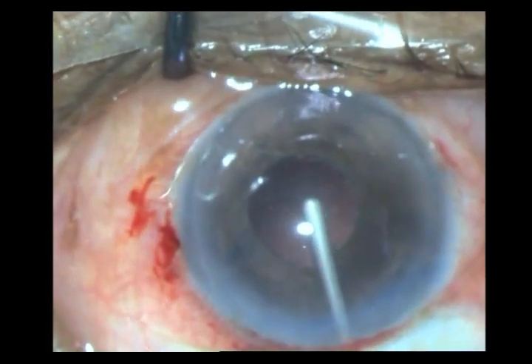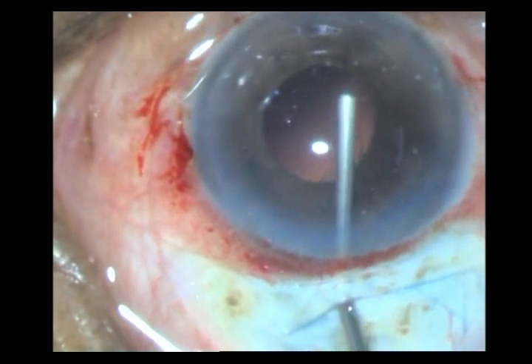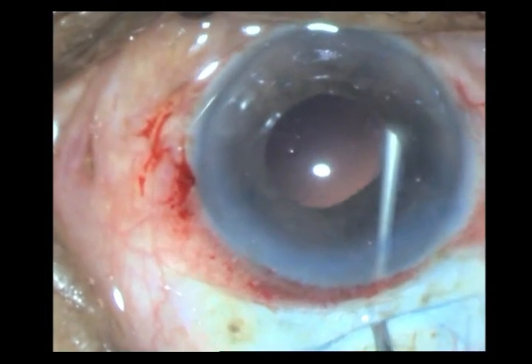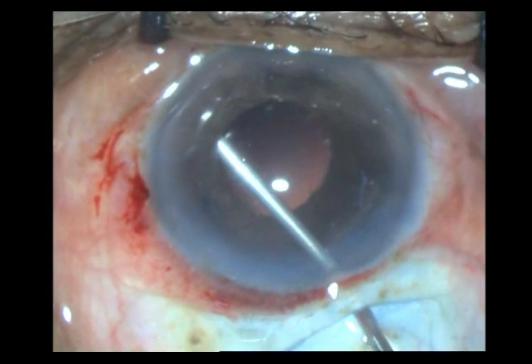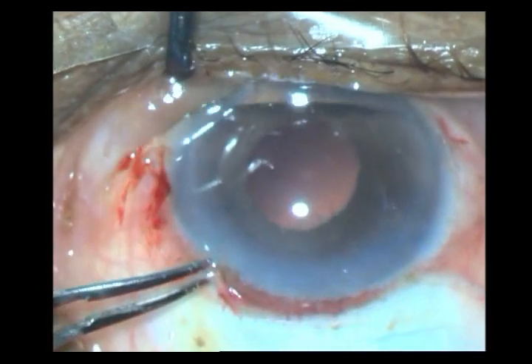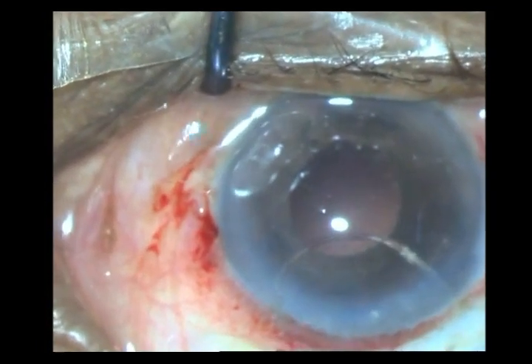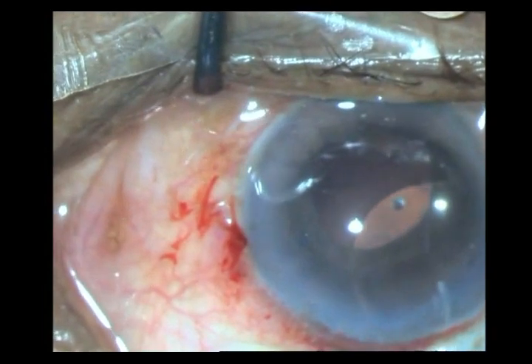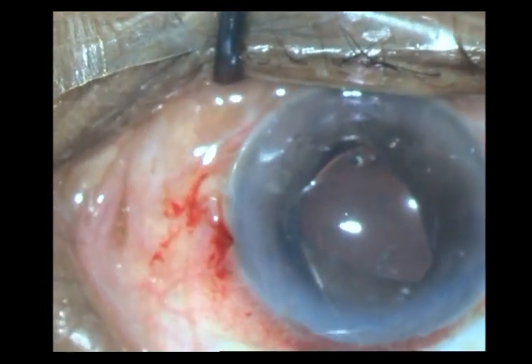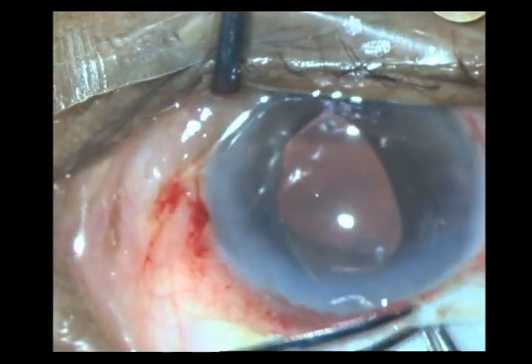I know there is not much cortex. I go ahead and put in some HPMC, also putting HPMC within the posterior chamber — just giving me some space between the posterior part of the iris and the anterior capsule. I do not want to put the lens into the bag as this bag is not going to be very stable, so I am putting my rigid PMMA lens into the sulcus. Very carefully — it is very important how you get it into the sulcus. See that your haptic tents up the iris and slowly goes and falls into the sulcus, because the second haptic is even more difficult.